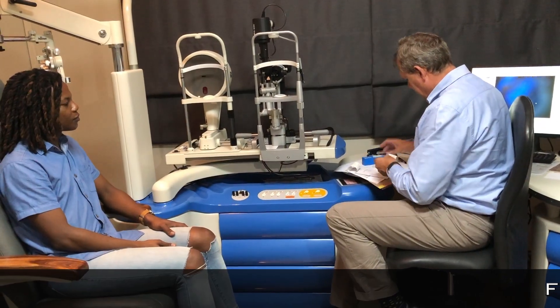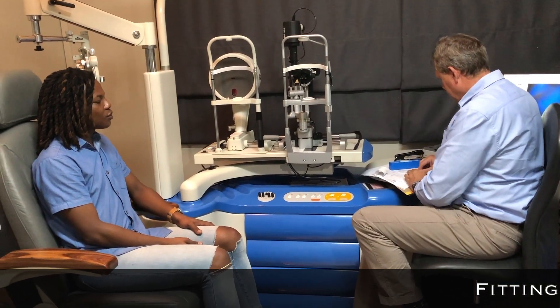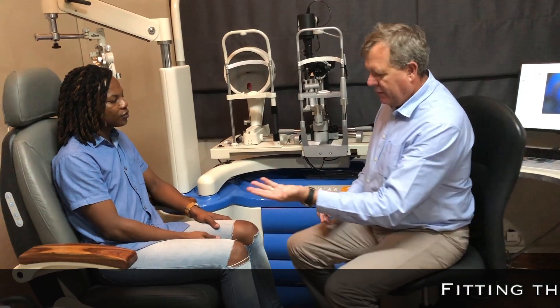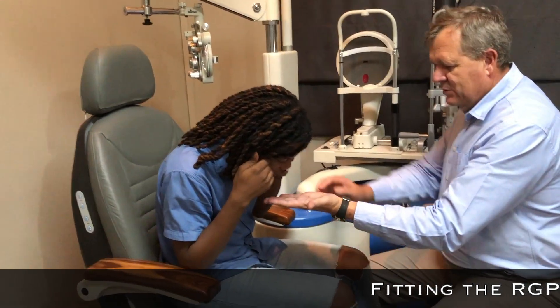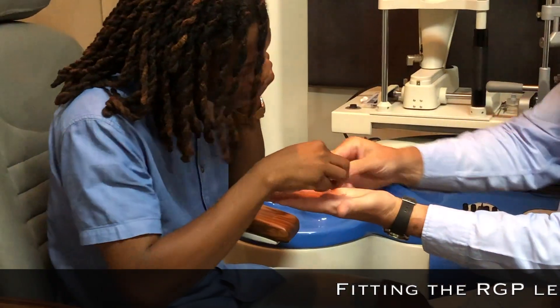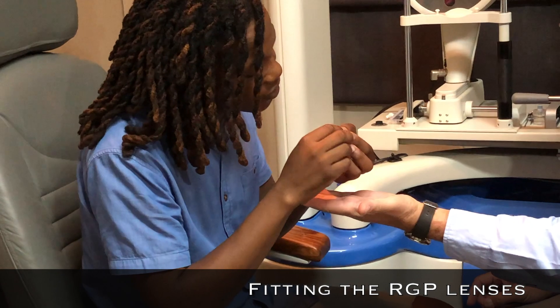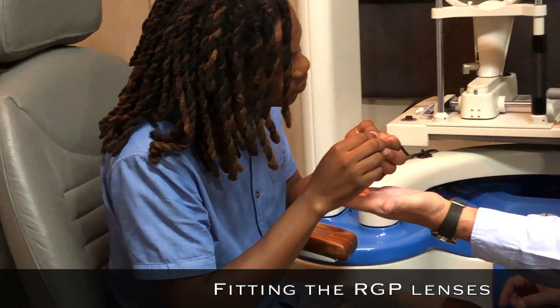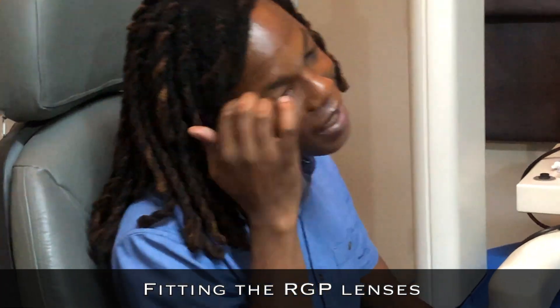So this is a hard lens. The diameter is nine millimeters, so it fits only on the colored part of your eye. It's very, very small. You can feel it's hard, so it's not easy for it to pop out, but it does. It sits quite stable. If you rub your eye and blink, it can pop out.